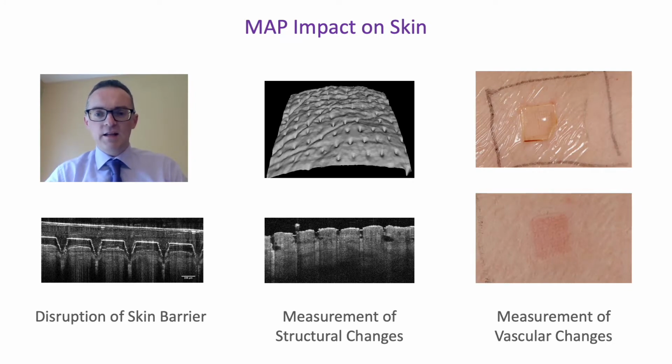What we have here is a series of images where we use both optical microscopy and optical coherence tomography to understand what happens when we insert a microneedle into the skin. We know that this is pain-free, but unless we use a technique like this where we can image into the skin, we can't really be sure how deep the microneedles would penetrate. Do they penetrate at all? And how might we measure what is happening to the skin while the microneedles are in place, but also when we remove them from the skin?